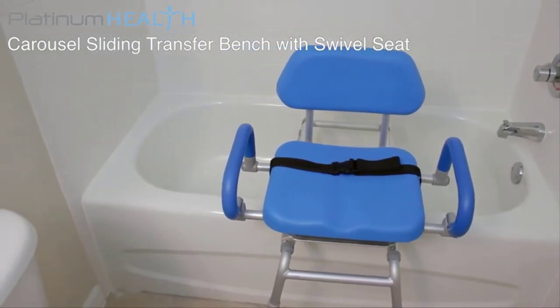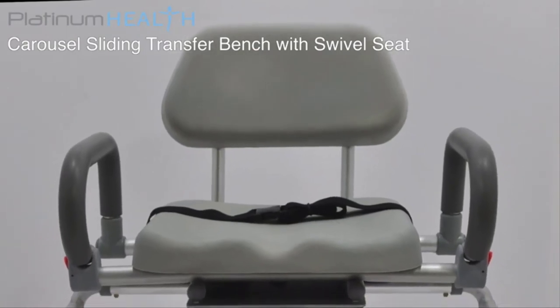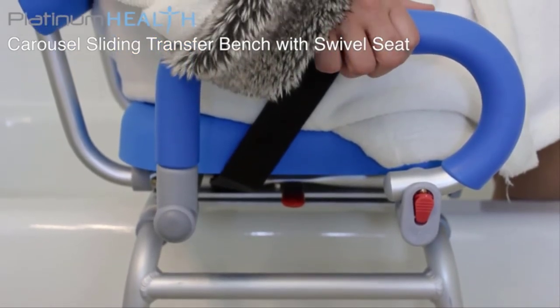One option is the signature high-view blue color that helps visually and cognitively impaired users more easily distinguish the chair from its surroundings to help prevent slips, trips and falls. The other color option is Moonshadow Gray, a more traditional color. The maximum weight capacity is 330 pounds.